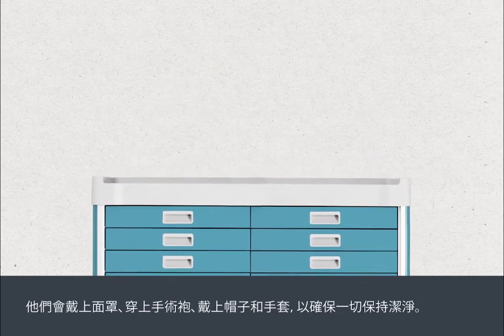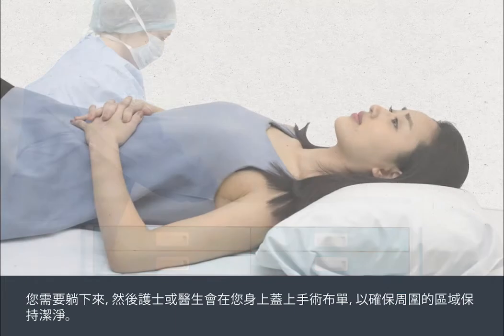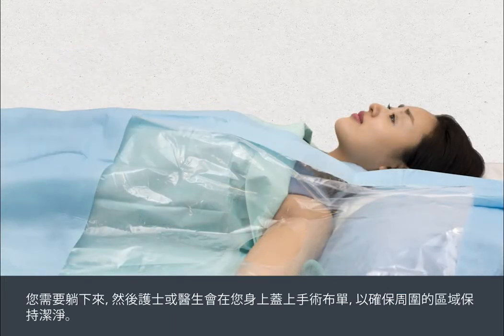They will wear a mask, gown, hat and gloves to make sure that everything is kept as clean as possible. You will need to lie down, and then the nurse or doctor will put drapes over you to make sure that the surrounding area is kept clean.